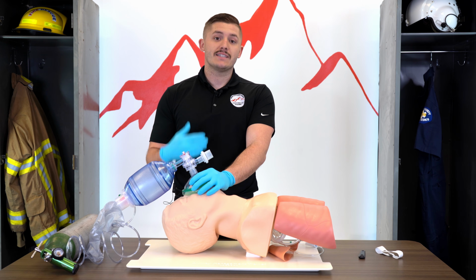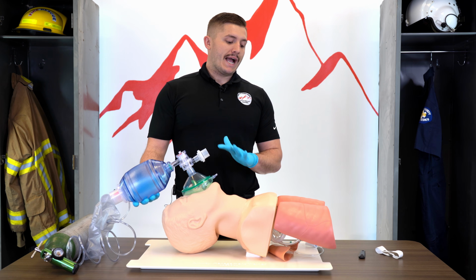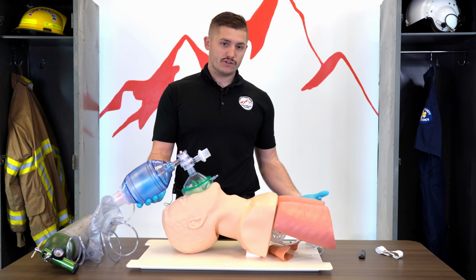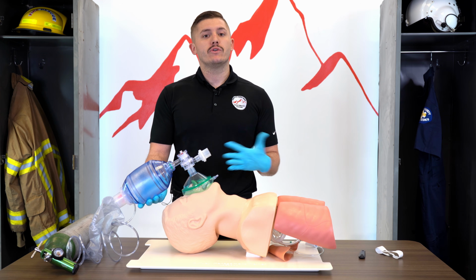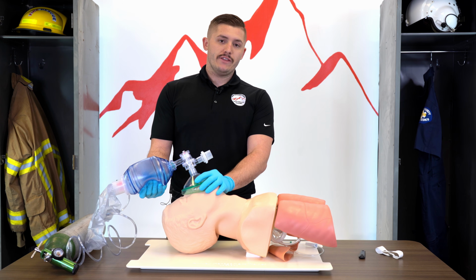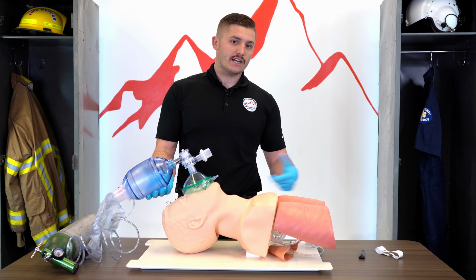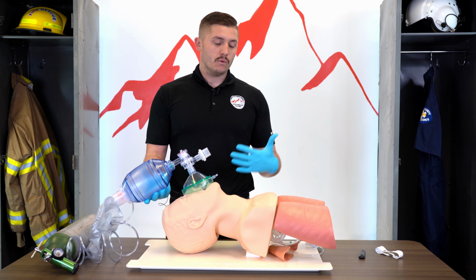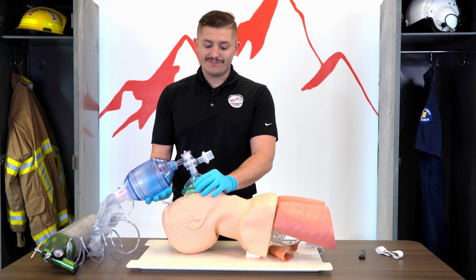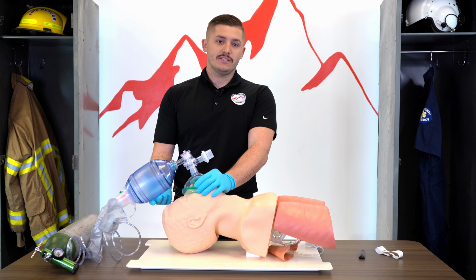It's just like that. It seems like it's taking very long to deliver a breath, but this way we're actually ventilating our patient and oxygenating our patient, allowing for circulation, maybe we're doing CPR. But if we over-oxygenate our patient, there's no gas exchange. There's no carbon dioxide that's actually going to circulate in the body as well, which is what we need to keep our patient alive. So it is very, very important for you to be giving one breath every 5 to 6 seconds.